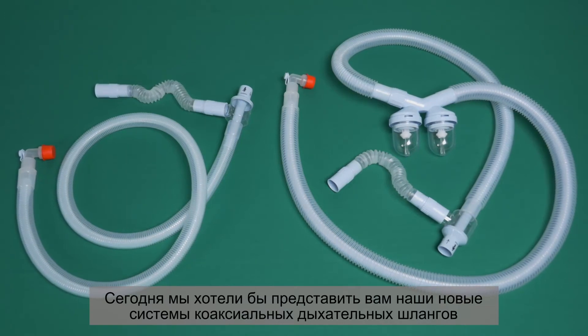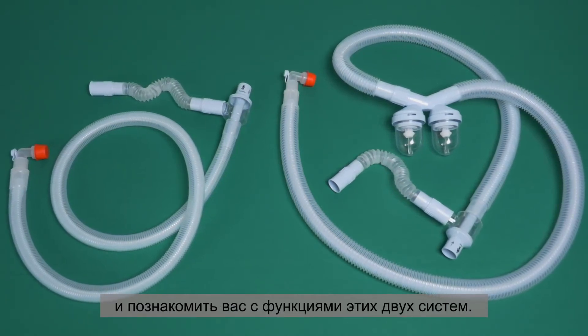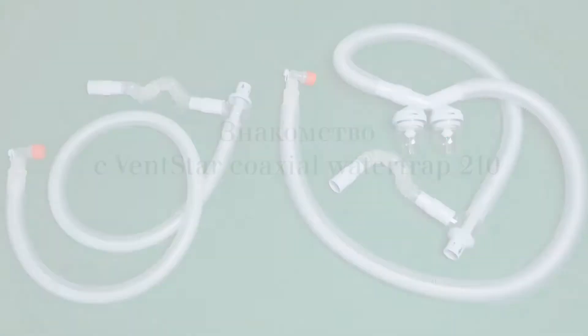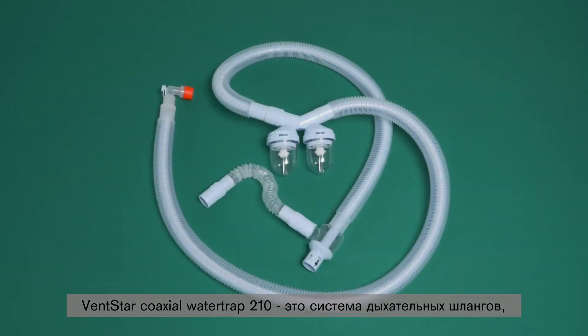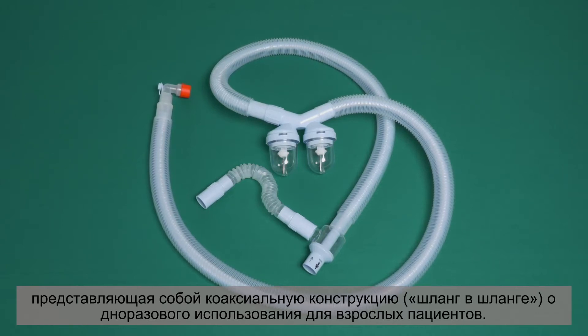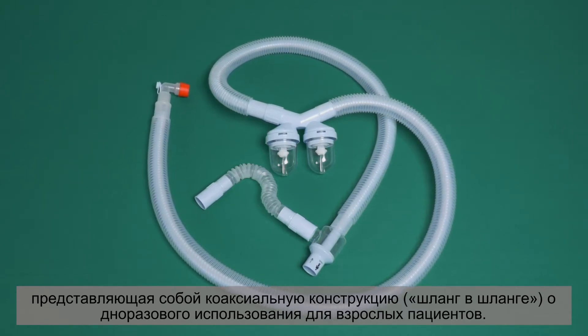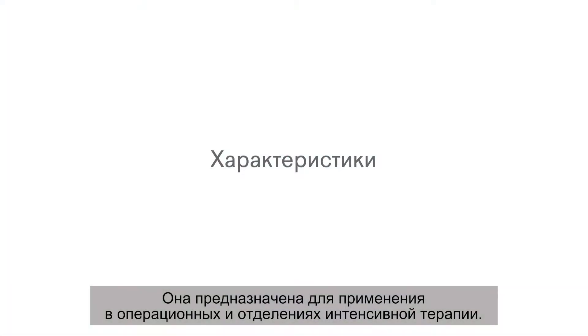Today, we would like to present our new coaxial breathing hose systems and introduce you to the functions of the two systems. The VentStar Coaxial Water Trap 210 is a breathing hose system with hose-in-hose design intended for single use on adult patients. Its scope of application includes the OR and intensive care.